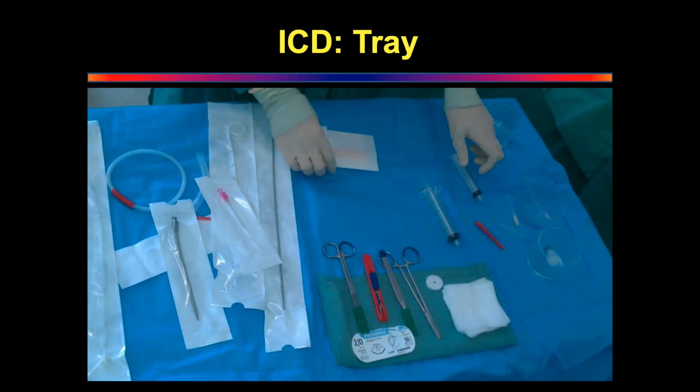Okay. Well done. What next? Then once you go up to the desired dilator diameter, then you put the pigtail catheter onto the guide wire and insert it. What is the intrapleural depth that you should go to? So that actually has to be gauged with the ultrasound guidance, sir. Yeah, but should you go in 10 centimeters? What is the intrapleural depth that you have to be careful about? Chest wall thickness? Yeah, it depends on the chest wall thickness. I'm talking about the intrapleural depth. Intrapleural, how much should you go?